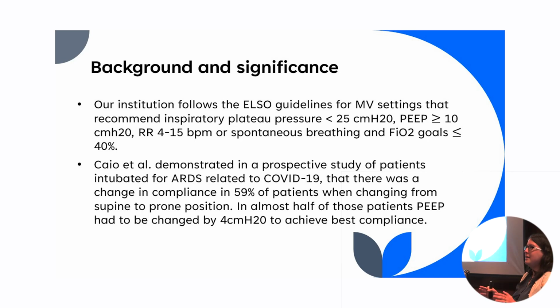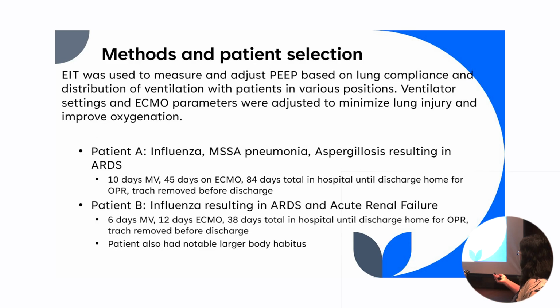So we know that, but it's hard to make that argument at the bedside, right, of, well, maybe we could go up on the PEEP a little bit more because that right side is more open. And it's hard to have that argument because you don't always have the numbers to quantify that. And that's where we've seen EIT change the tide for us. And we're going to get into that.